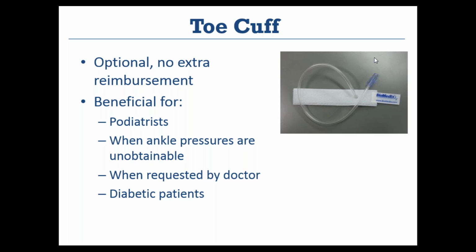I also want to take a moment to highlight that it can sometimes be very difficult, especially with diabetic patients, to get a toe pressure or a toe PVR in the patient's toes if they're cold. So if you know that you're going to need toe pressures or toe PVRs, take action at the beginning of the study to keep the patient's feet warm.